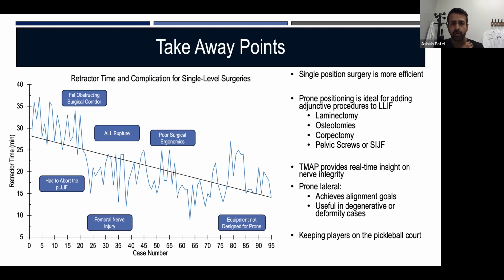But just like if you perform an inadvertent ALL resection or an actual intended ALL resection, you've got to go as far posteriorly as you can. If the nerve is allowing you and the EMG stim are favorable and you can march backwards in the disc space and redock and take out more posterior disc, you can then force the implant posteriorly and then orthogonalize so that the implant is as posterior as you can place it.